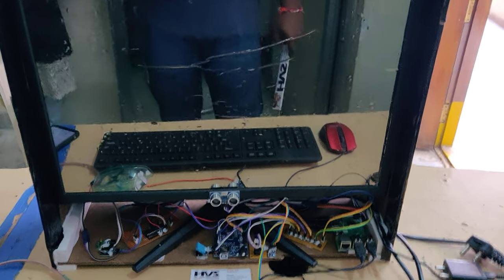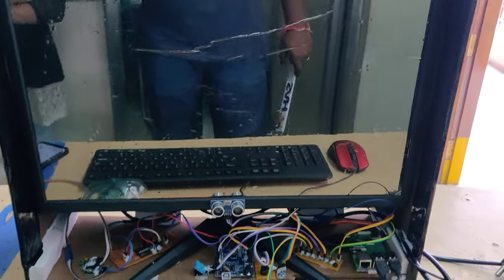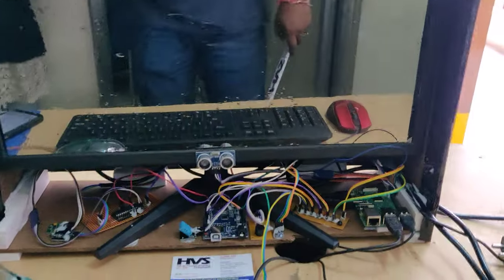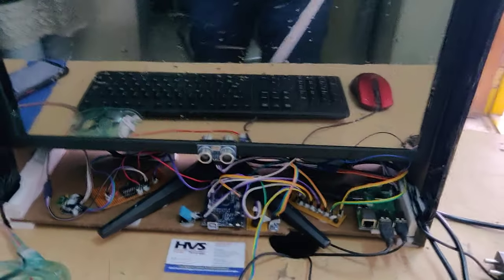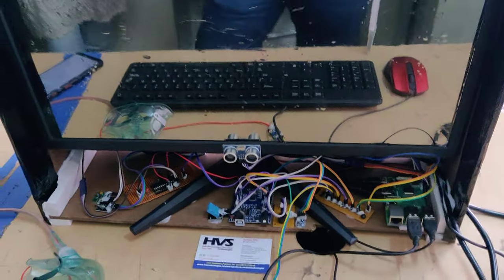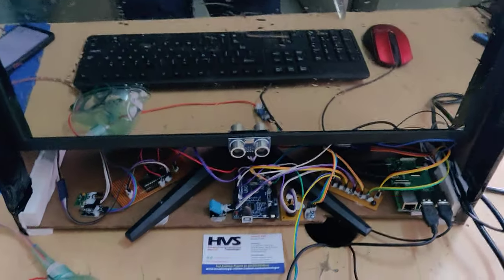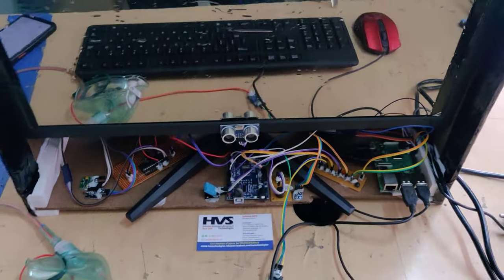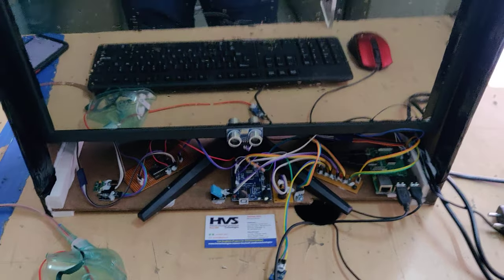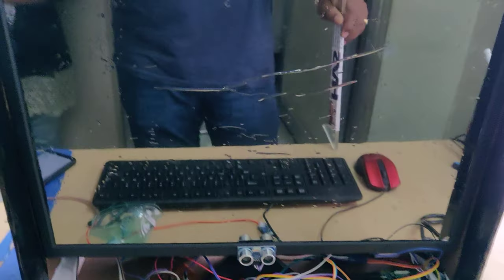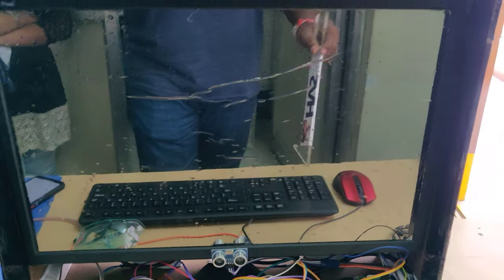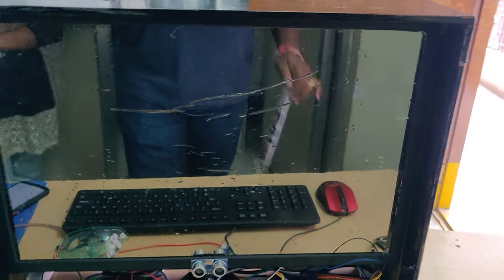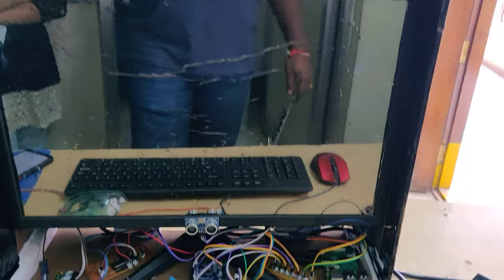Welcome to the project demonstration of smart mirror using Raspberry Pi for environmental and health parameters monitoring system. Here, a total of eight parameters are continuously monitored and displayed on this mirror screen along with date and time.